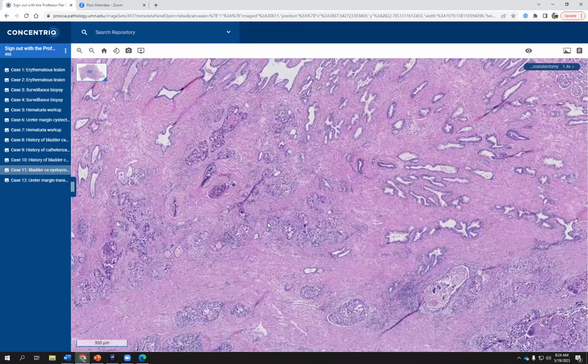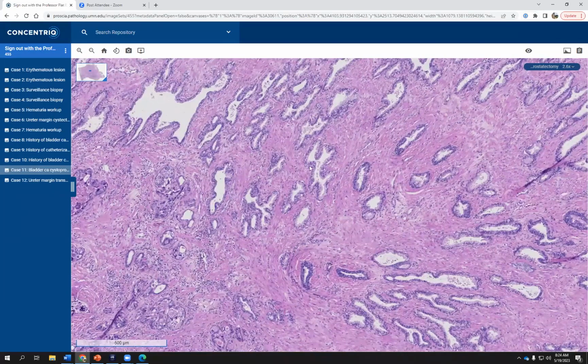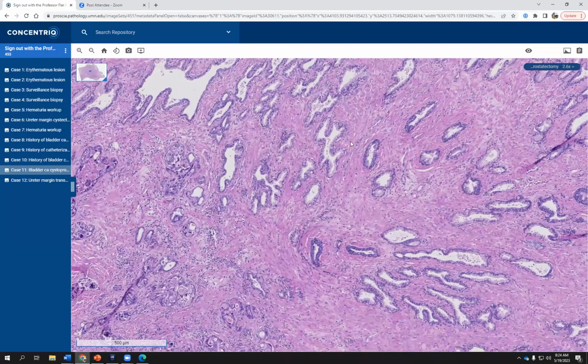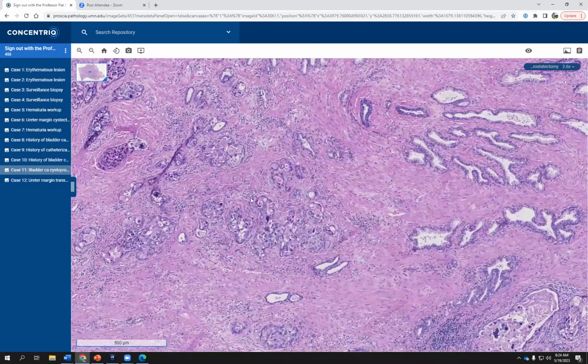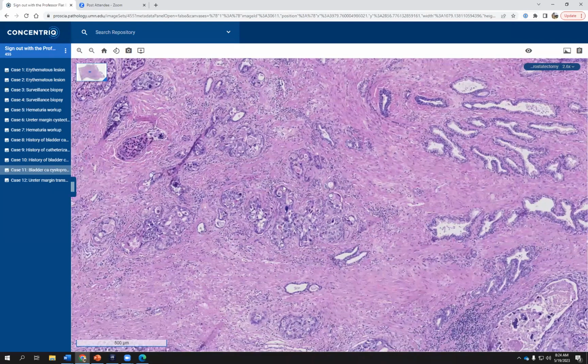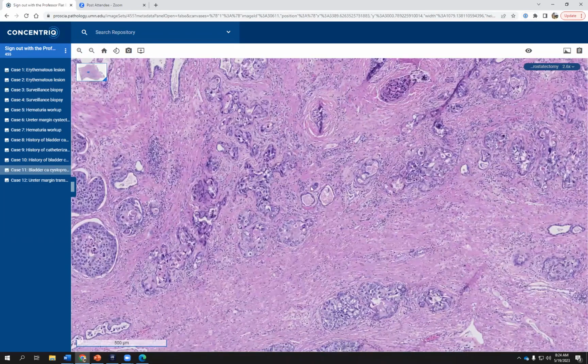And that is because if you look at the prostatic acini, they do have this irregular, jagged shape, right? So when the urothelial carcinoma enters this, they are going to follow the same contour. So that is the reason for it being jagged, just because they follow the contour of the prostatic acini, not because they are irregular and infiltrative.